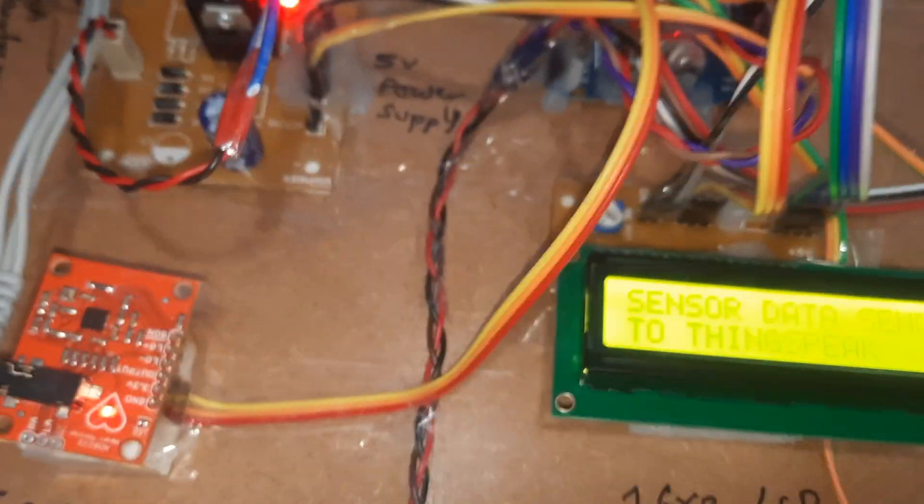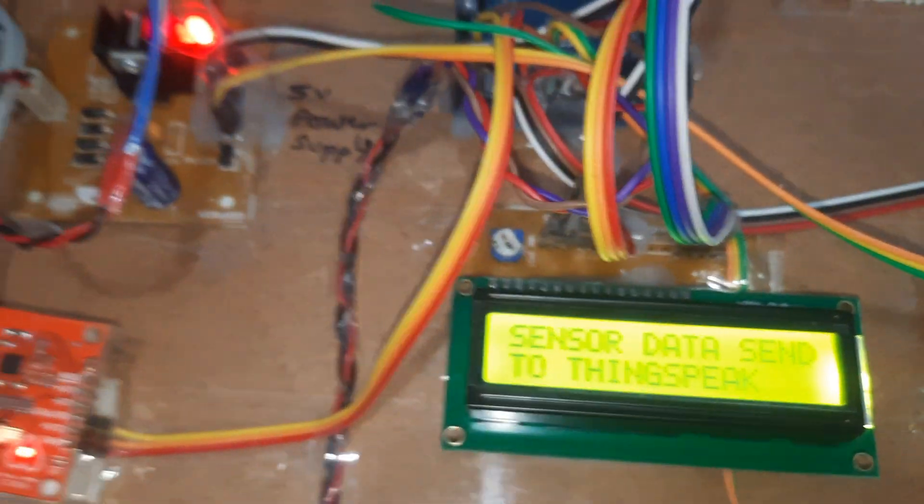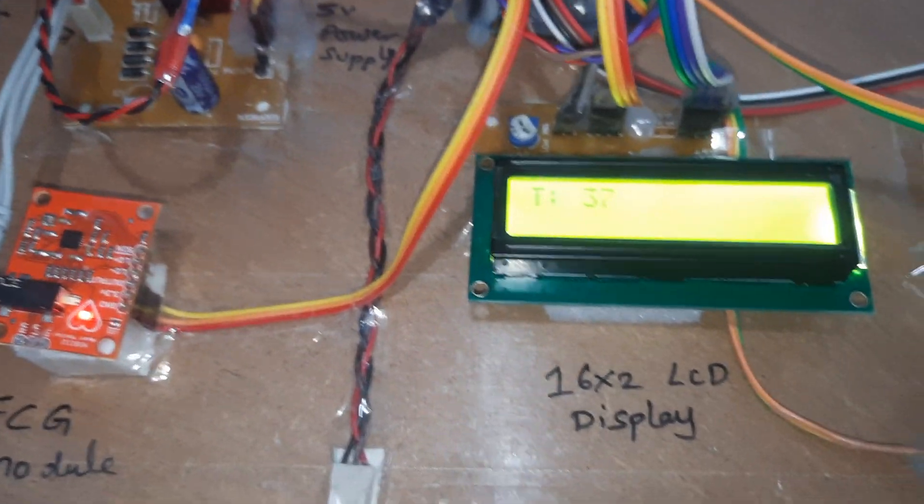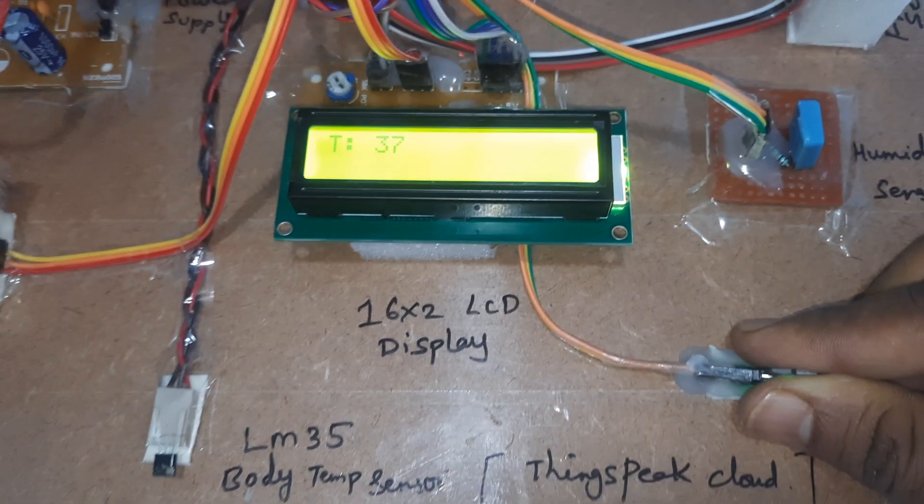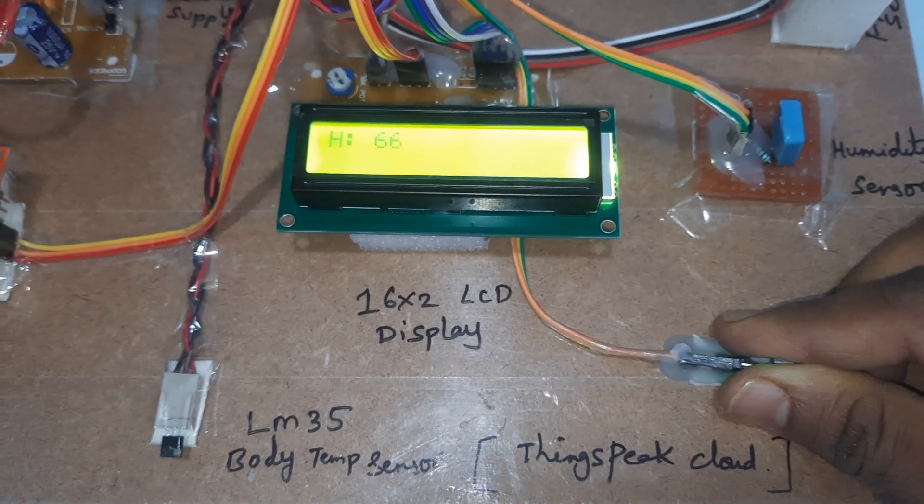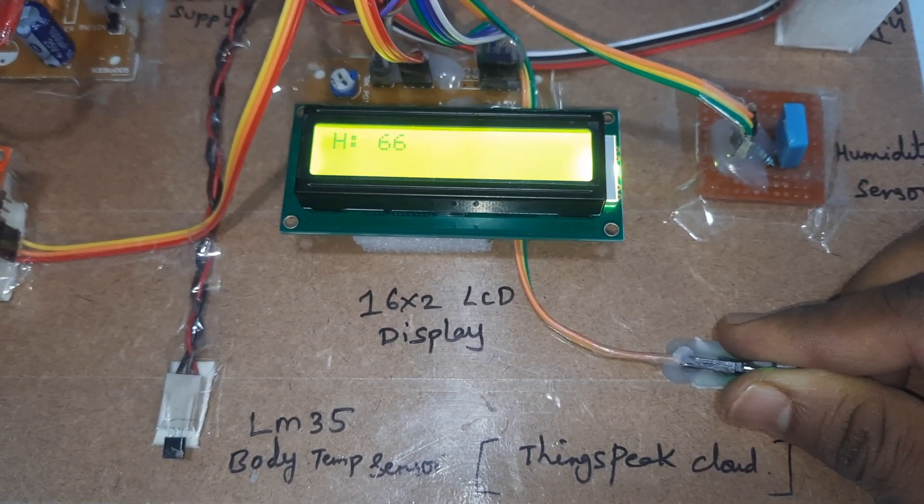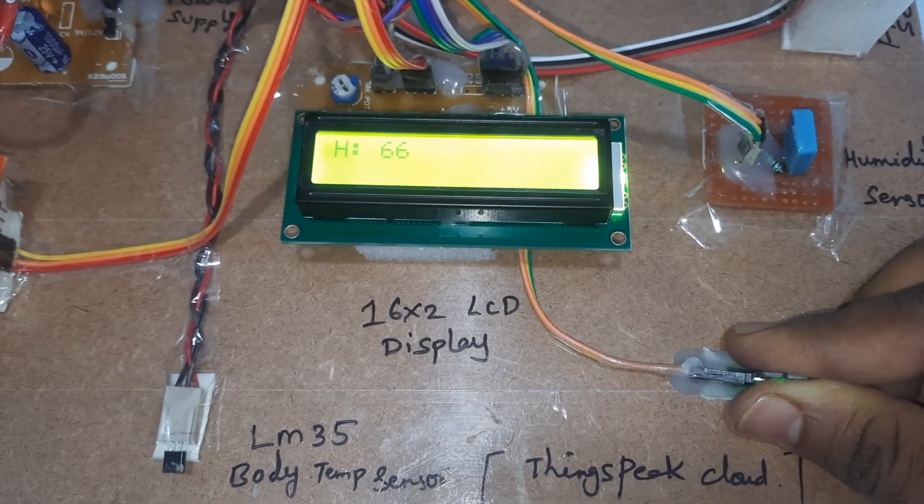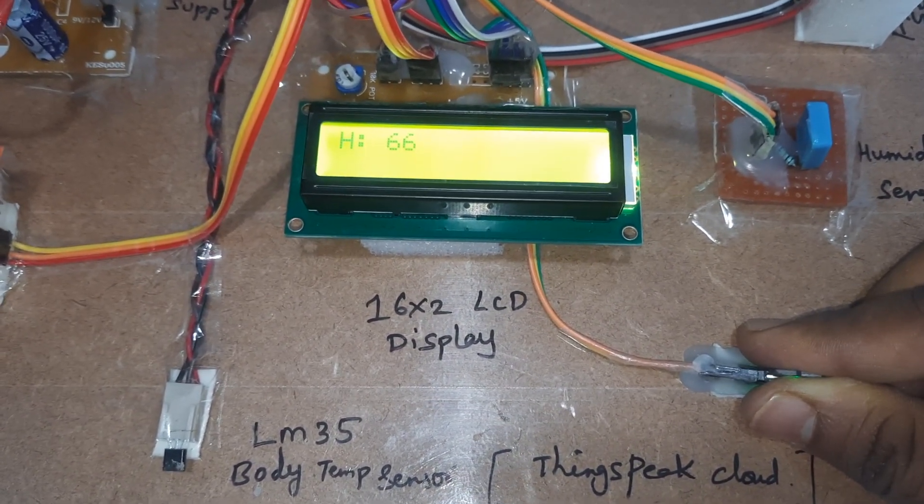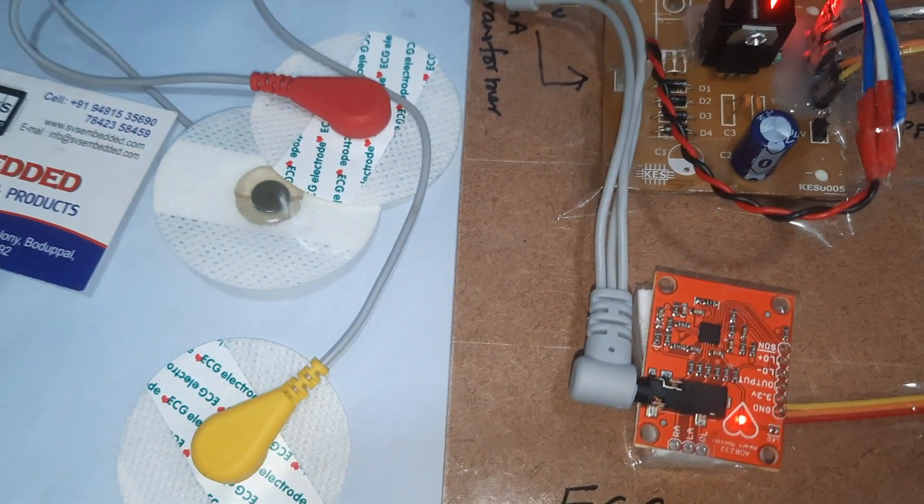Now I am giving high humidity. T for temperature, H for humidity. You have to wear the ECG to your body.